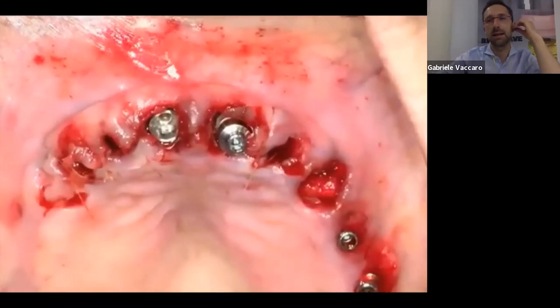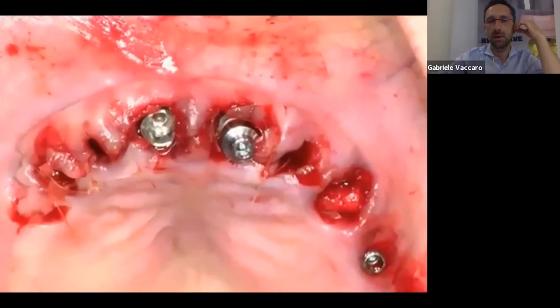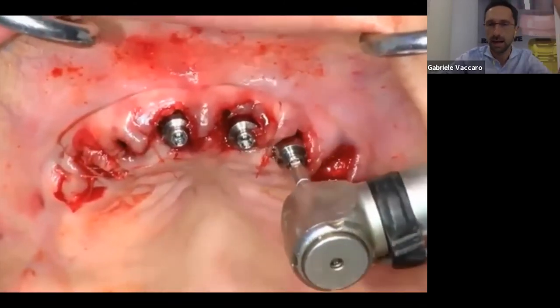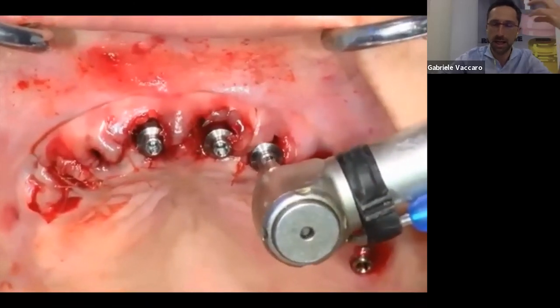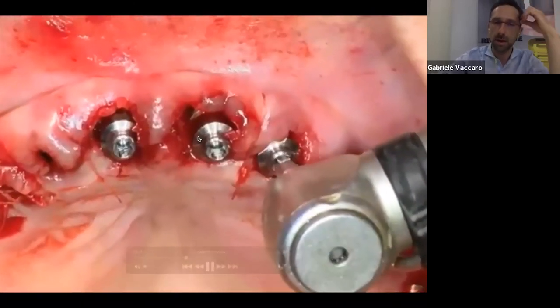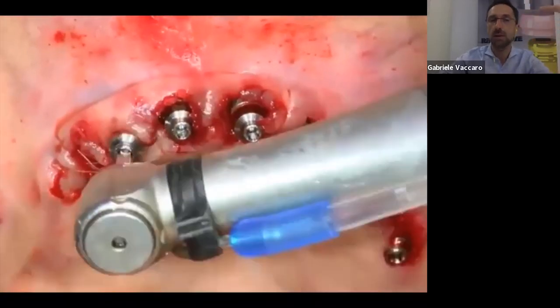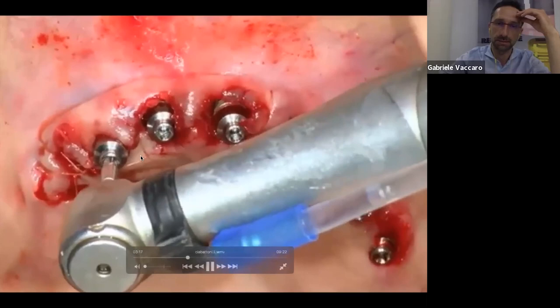We are never going to open this during the lifetime of the prosthesis. Even if the patient breaks the ceramic, even if the patient breaks everything and we need to unscrew everything, we are always going to unscrew it outside of the gingiva.